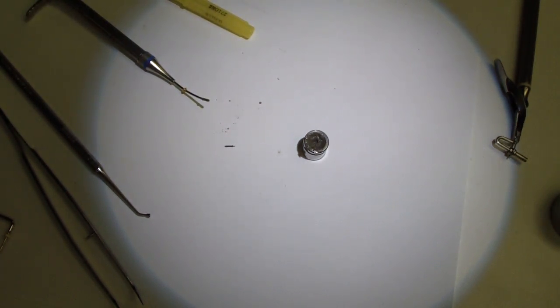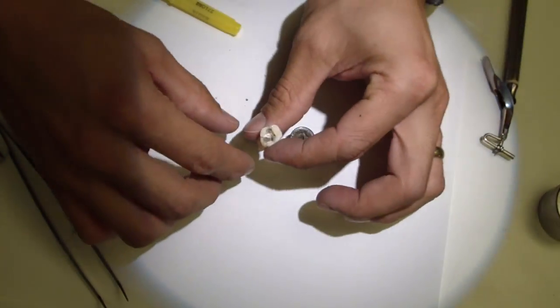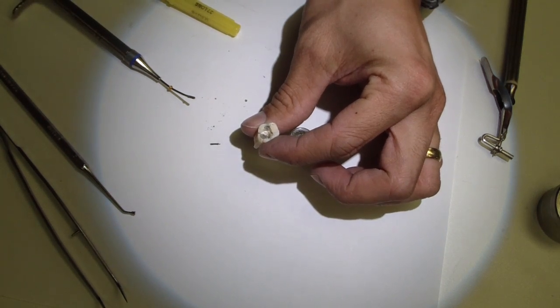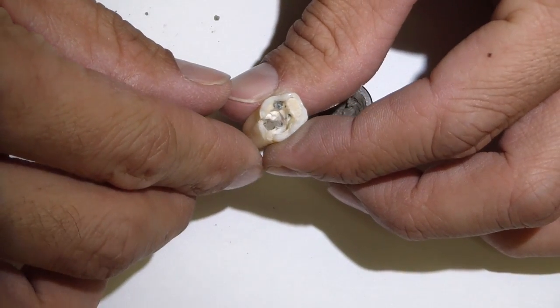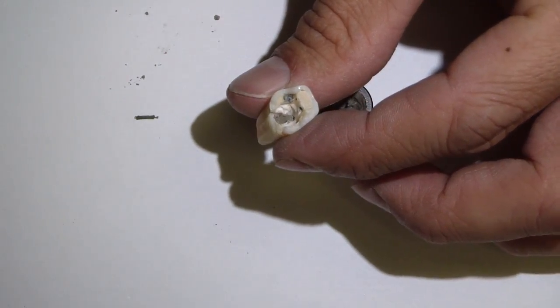So what you can do with this material is fairly significant. And let me just show you with this perforation I made, the furcation, this mandibular molar. I filled it already once with MTA in a previous demonstration.